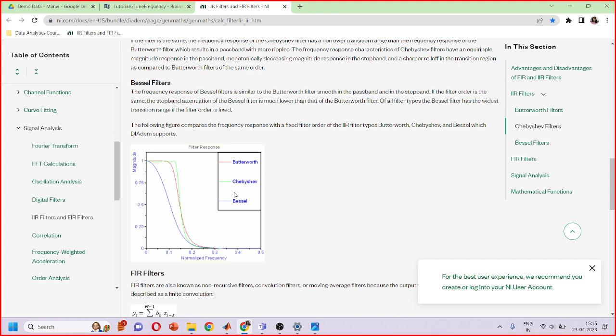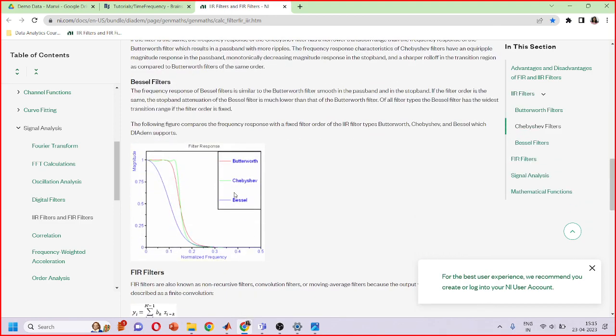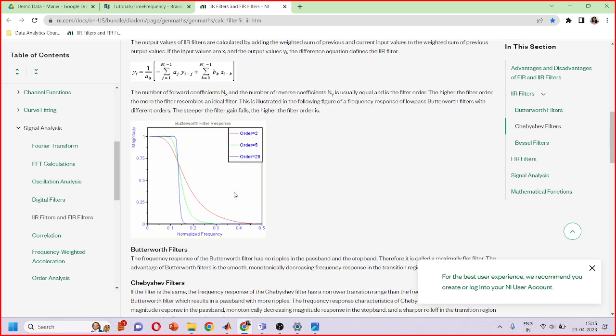It's just that if you are using finite filters, they limit you to a particular number that you're giving them, right? But in case you're using an infinite filter, that will actually take you to an extended phase, a time delay, which is not what you chose.